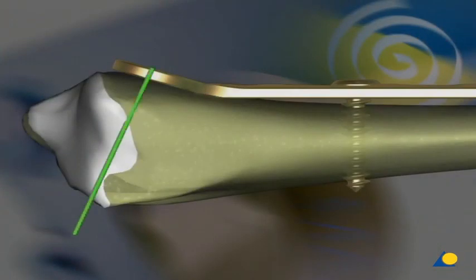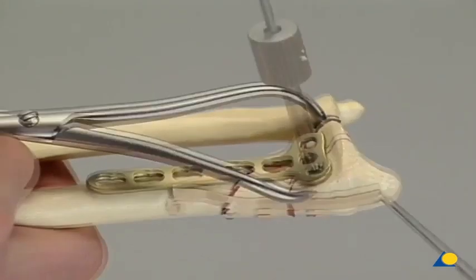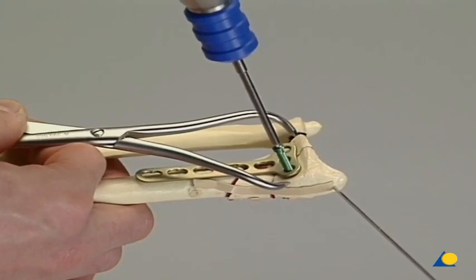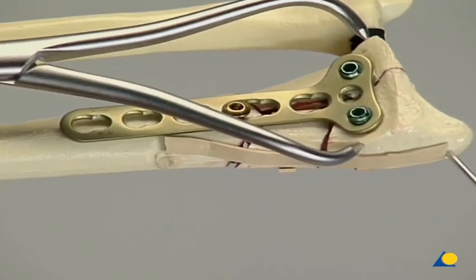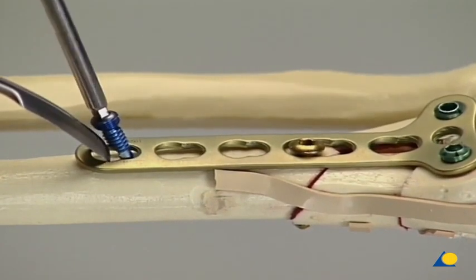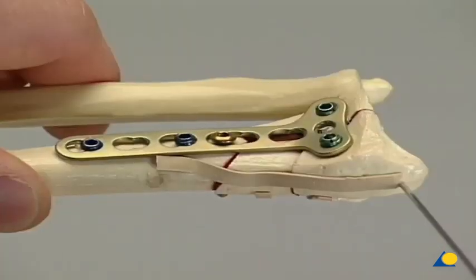In the juxta-articular zone, the threaded holes of certain LCPs are not aligned orthogonally with the surface of the plate. This allows the screws to be seated as close as possible to the joint without perforating the cartilage. Drilling is performed using the 2.8 millimeter drill bit. The length is measured, and the selected locking head screws are inserted using a power tool and the torque limiting attachment. Loosening of the first screw allows fine reduction through the plate. Final fixation of the LCP to the shaft is performed ideally by means of locking head screws. An internal fixation with correct axial alignment and length has been achieved.